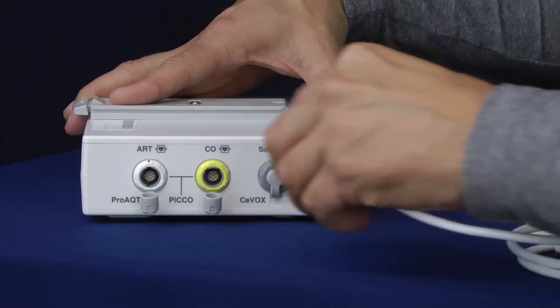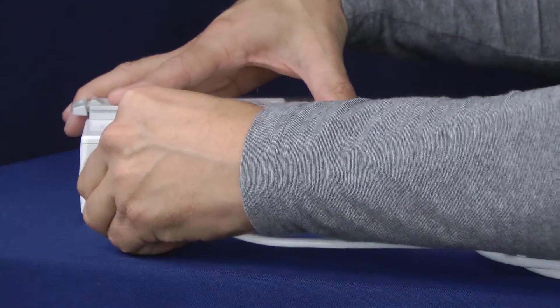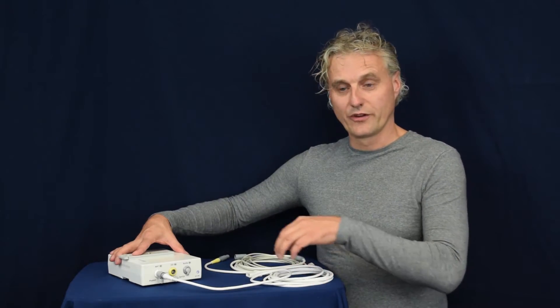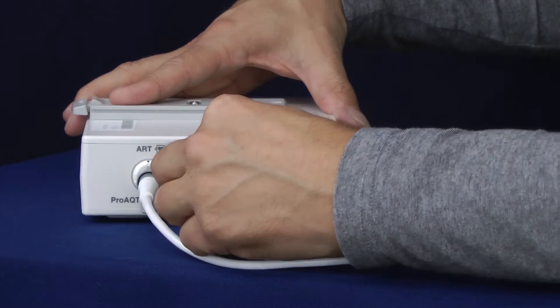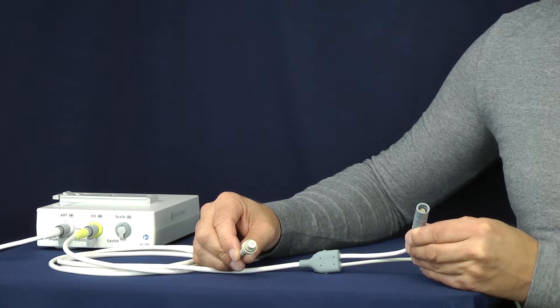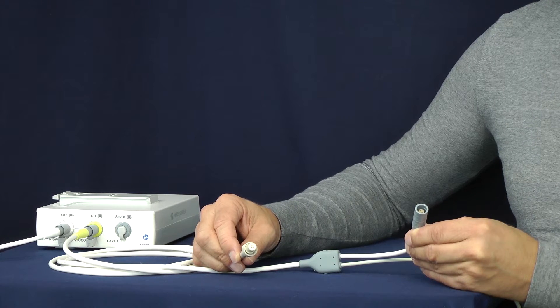The IBP connection cord will go into the white labelled connector, and the CO connection cord will go into the yellow. The CO connection cord has two connections — one is going to the PiCCO catheter and the other one is going to the PiCCO injectate sensor cable.